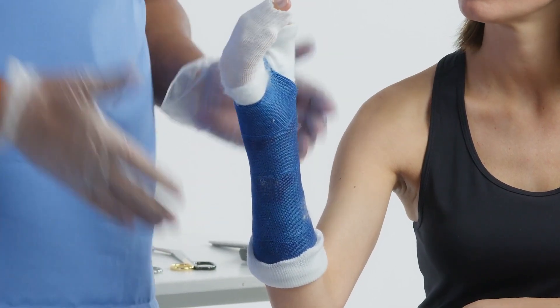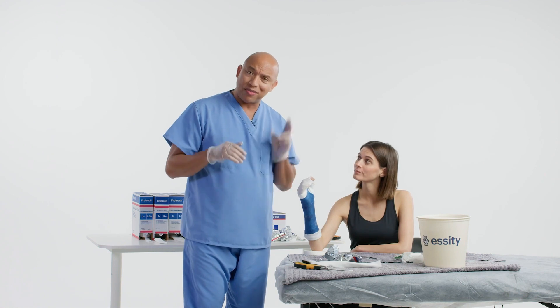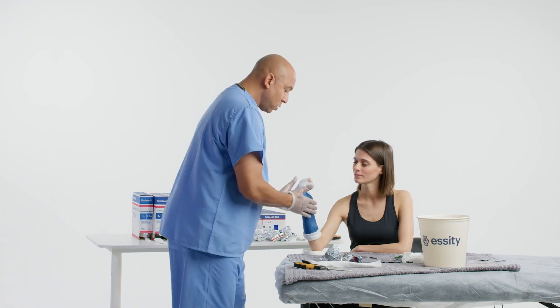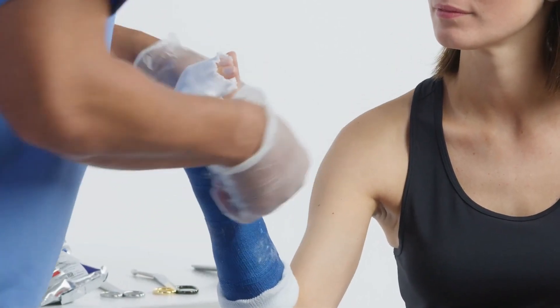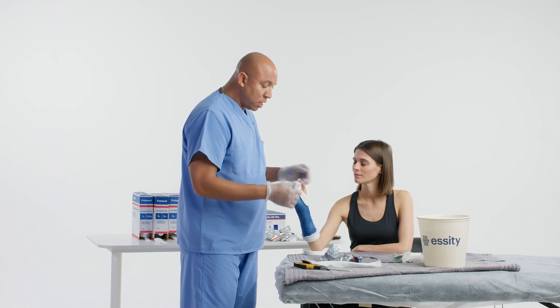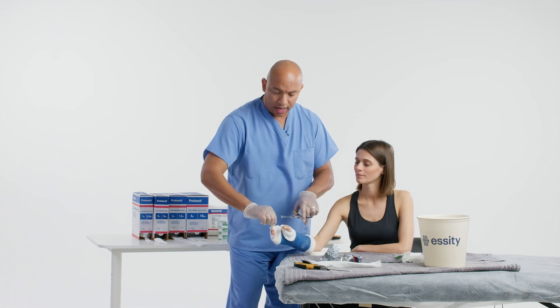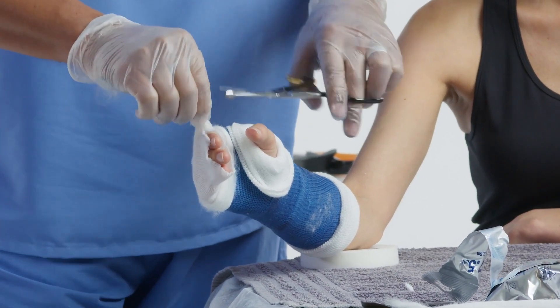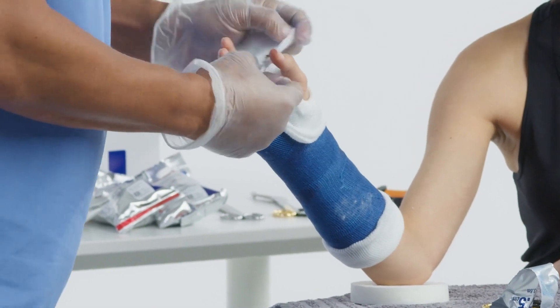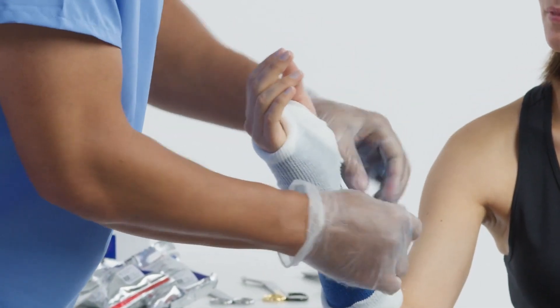Now I'm fixing the stockinette because I'm going to roll it over and we're going to add our cosmetic layer. It serves two purposes: it makes it look a little bit better at the end, and we want to add some more cast tape for strength. I'll lower this down around the thumb and then around the index finger. You can find the PIP joint of the index finger, cut there, and then wrap that portion around the thumb.